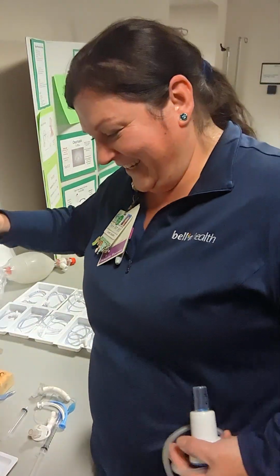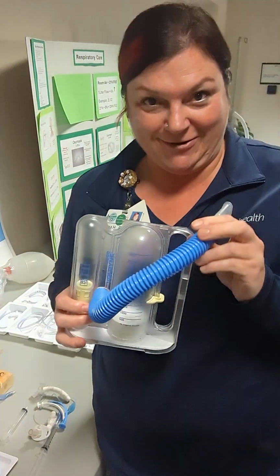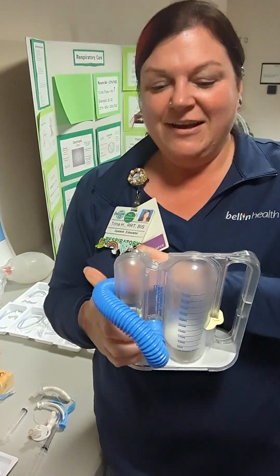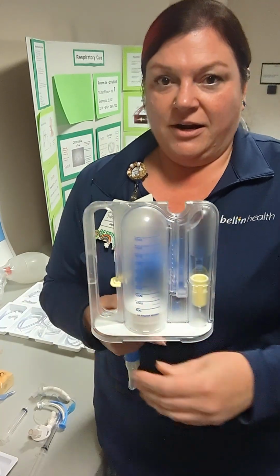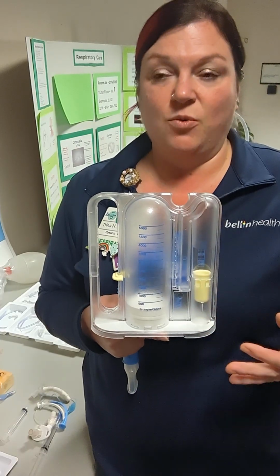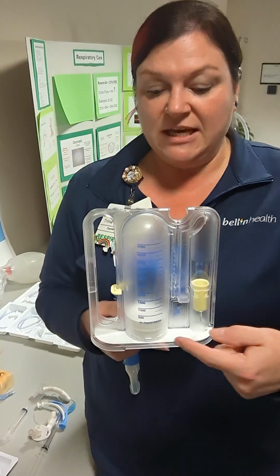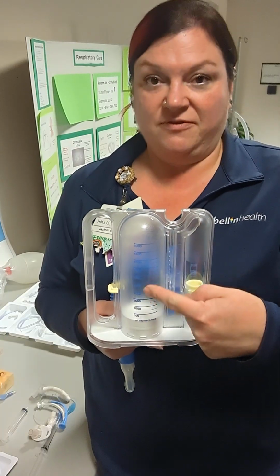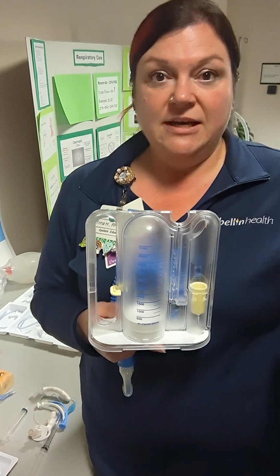Slippery fingers. All right, so this is incentive spirometry, right? We all know this, we love it, it's our favorite. A few things to point out: there are two different points of interest for us as we're watching our patients and encouraging them to take these deep, slow, deep breaths. The first is the measurement of the size of the breath, and we are measuring that in milliliters.